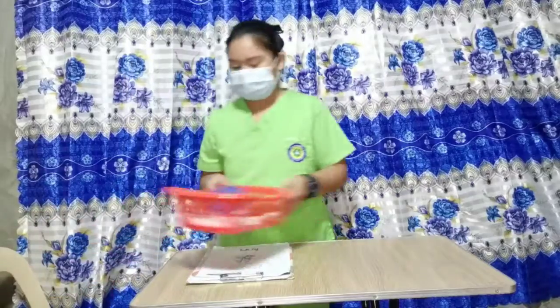Good evening, ma'am. My name is Karen Salvatera, a BSN student, and today I will be administering medication through intradermal injection. Gather all materials needed.